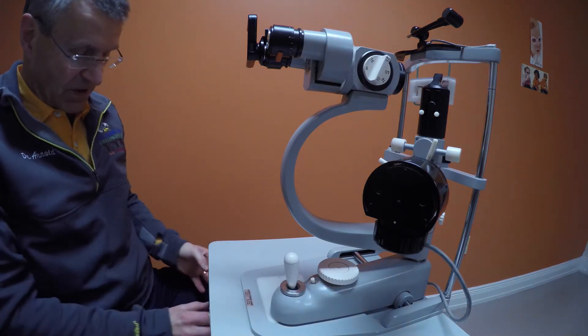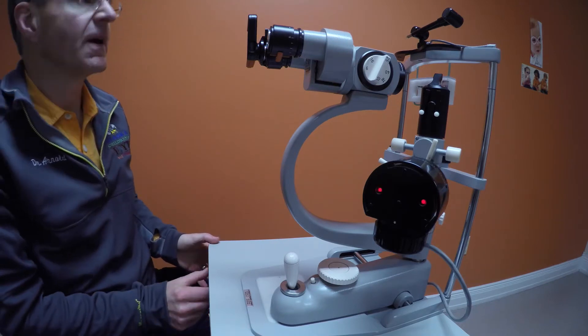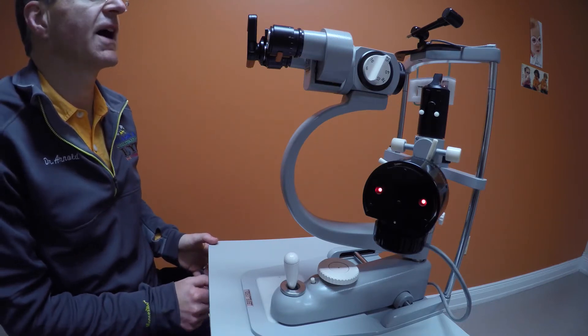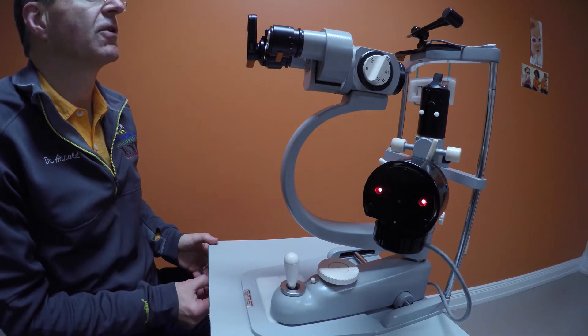The slit lamp is turned on with a button on the bottom, and that button also has a rheostat to turn it very bright or very dim.